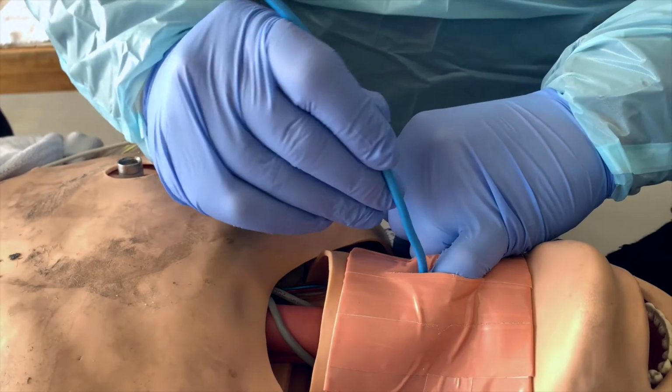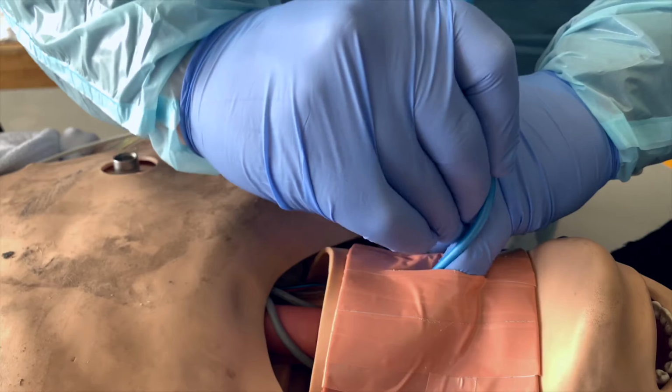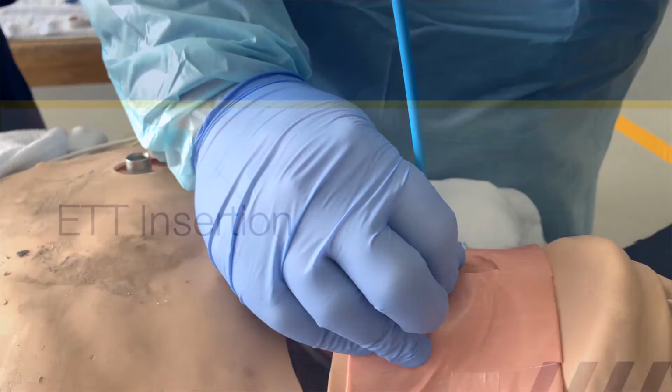Place the bougie inferior to the inserted finger while guiding it into the trachea towards the chest until resistance is felt. Don't force the bougie, as it will often get held up at the carina. Remove the finger once the bougie has been completely inserted, ensuring the bougie remains in place.